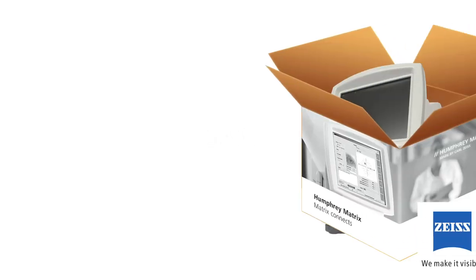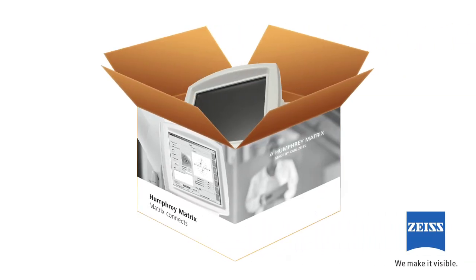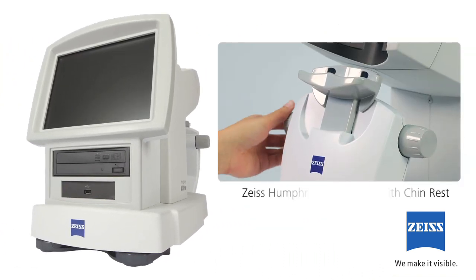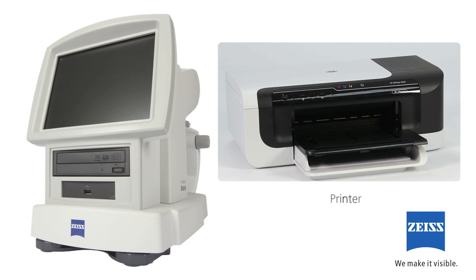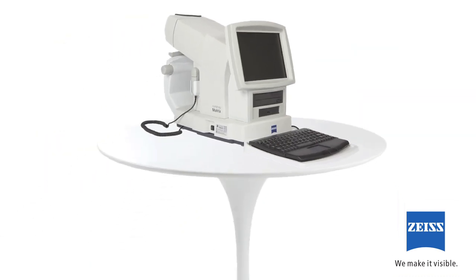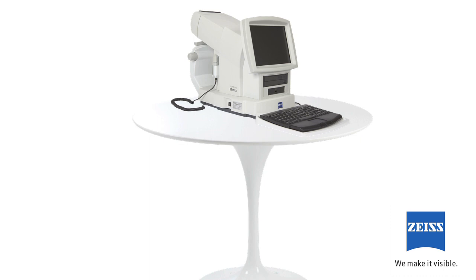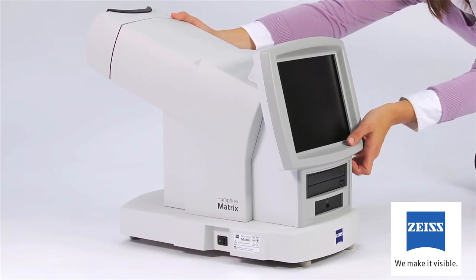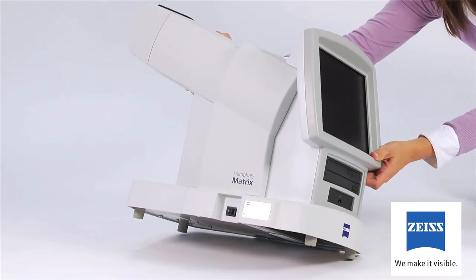To begin, check the contents of the instrument shipping box with the packing slip. Your Humphrey Matrix 800 ships with a chin rest, keyboard tray, and printer. Because of its lightweight and small size, your Humphrey Matrix 800 can be set up virtually anywhere in your office. Once you've chosen the location, prepare the instrument for use by connecting all of the components.